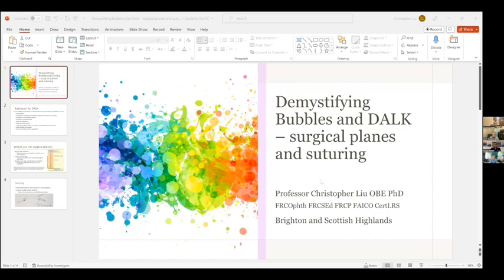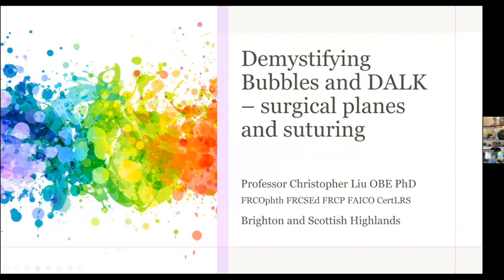Yes, thank you. So this session is about surgical planes and a little bit about suturing in DALK. There is a lot of misunderstanding for a lot of people, not everybody, about the surgical planes, and so I have assembled some experts to demystify this. I just want to open the session with 3 slides. So I'm going to talk about surgical planes and suturing.